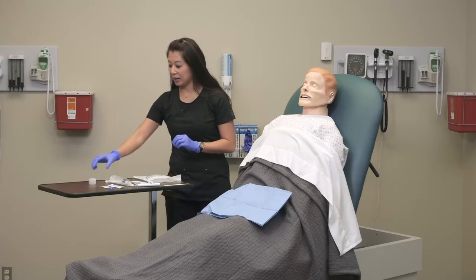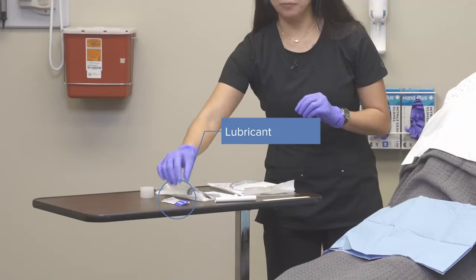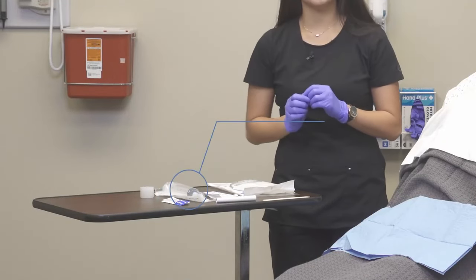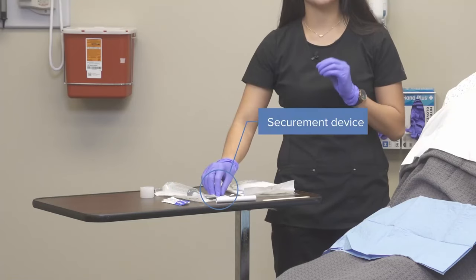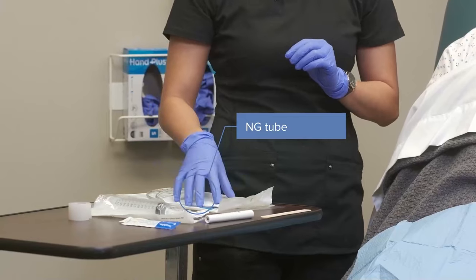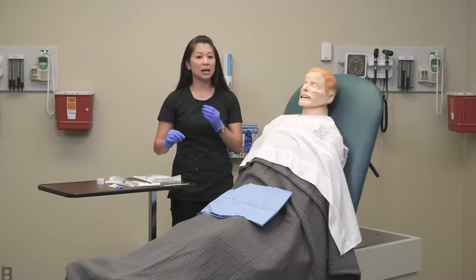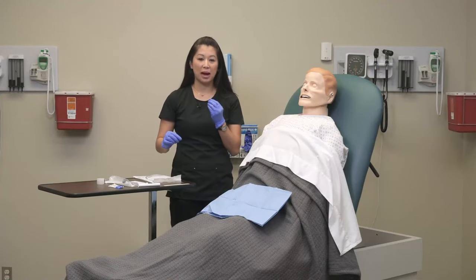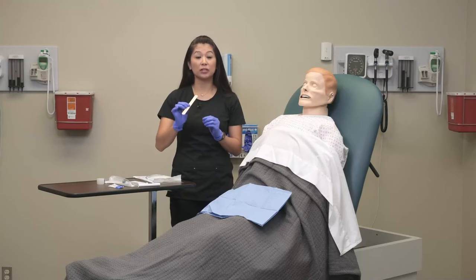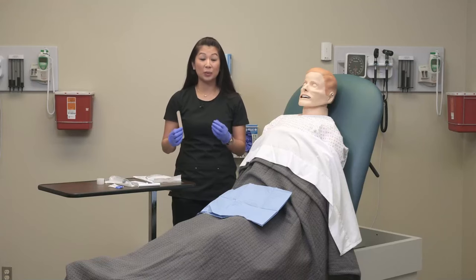Let's take a look at the equipment. I've got tape for marking, lubricant, a piston syringe, a nasogastric securement strip, our nasogastric tube — I'm using the Salem sump today — a pin light for visualization, and a tongue depressor so you can push down the patient's tongue and look inside their mouth. Any time you place a nasogastric tube, it's always great to have a second set of hands.